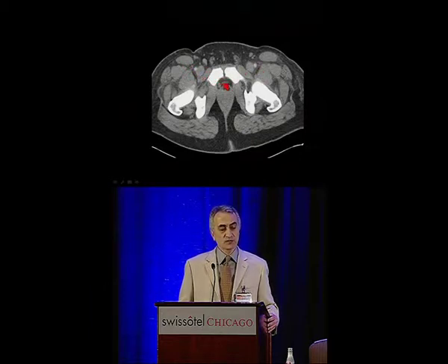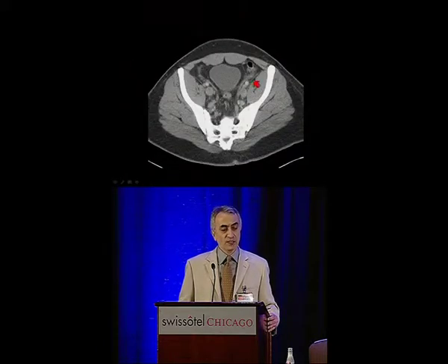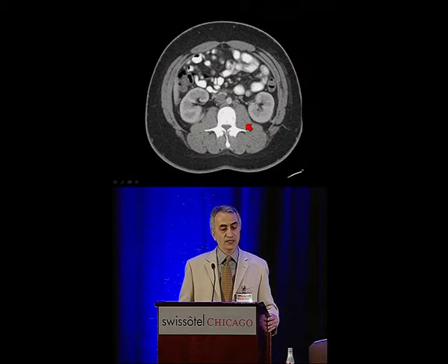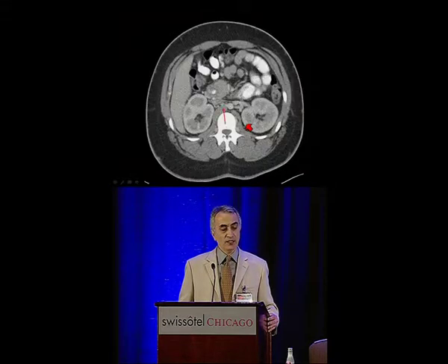This was really done from arterial. It's not a good CT venogram. But you can see here the veins expanded, a little bit of inflammation around them. Now you're beginning to see a lot of dots and blots around here. They're telling you that probably these veins are occluded. And here's a little bit higher up, and you can see that now here's the expected position of the IVC, and there's just not much there.